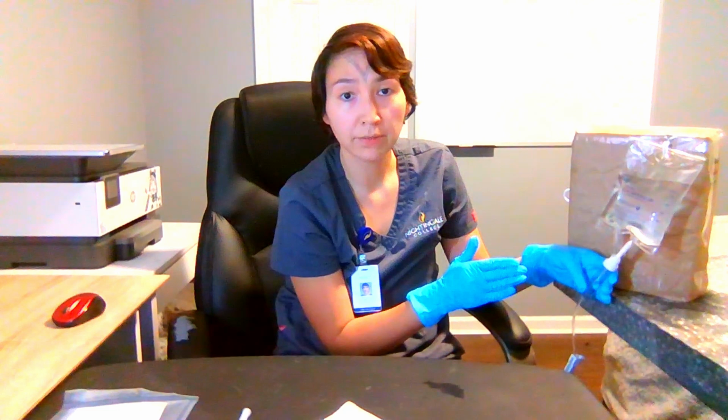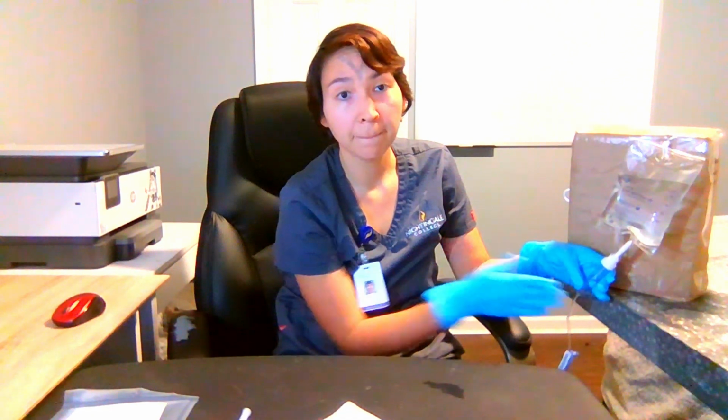The drop rate for the ordered fluid of 150 ml per hour was calculated to 38 drops per minute.